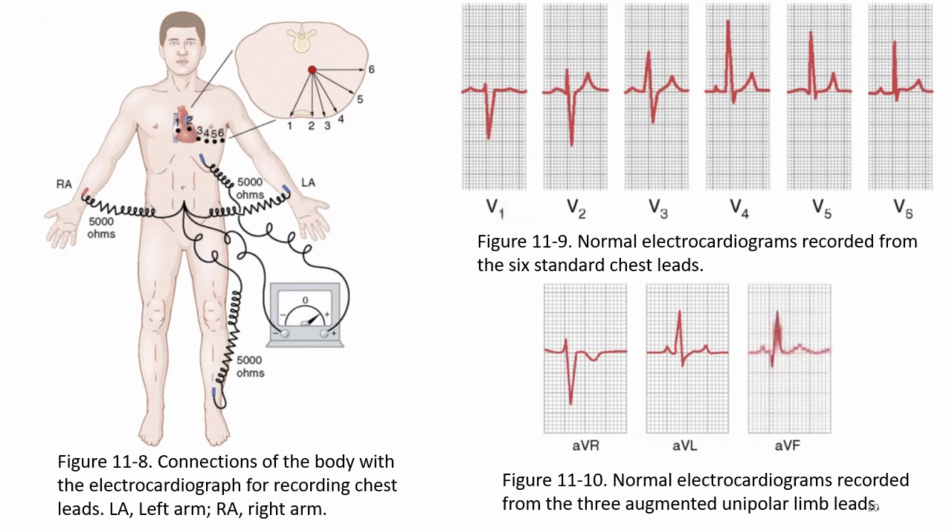To understand how these waves are formed, I recommend you read the Guyton and Hall textbook of medical physiology about the electrocardiography topic. If a wave is coming toward an electrode, it records upwards and positive, and the size of the wave corresponds to the voltage amount. If it goes down, it means that it is going away from this electrode.